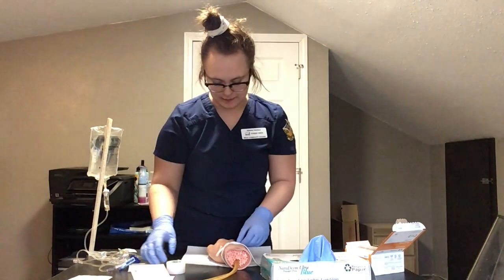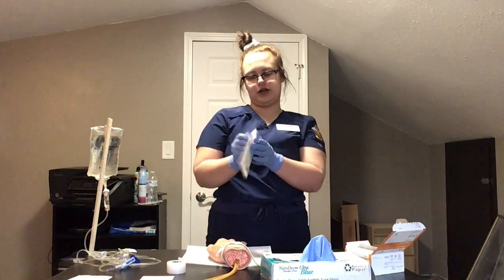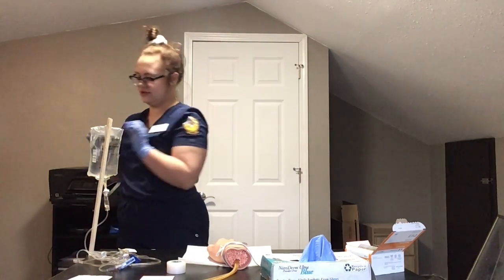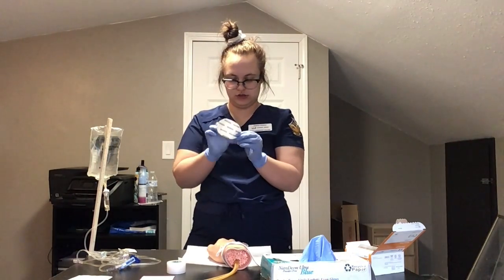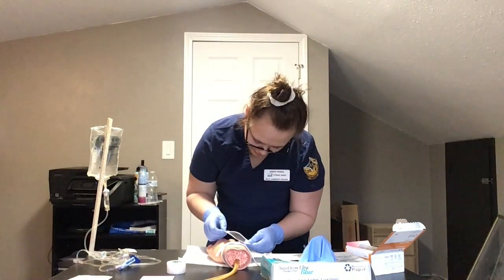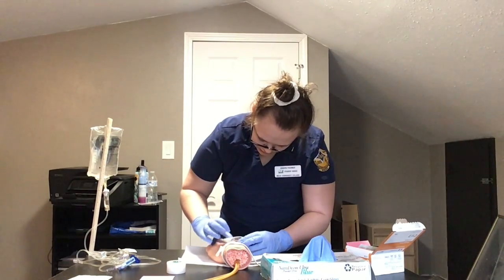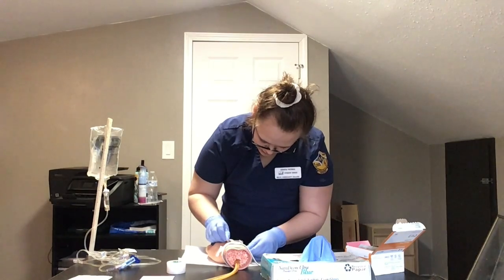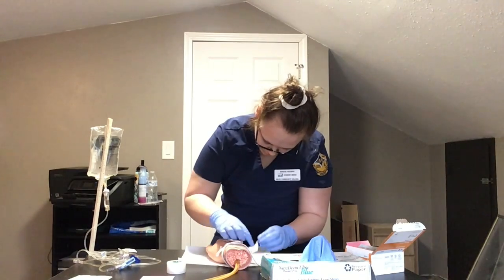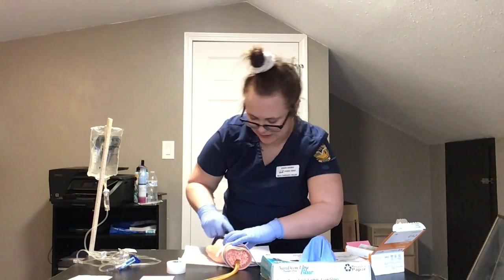Okay. Now that that is in, I'm going to get my transparent dressing. Be careful not to touch it where it's going to be on my patient. Place it over the IV site but not covering the port. And then I would label that with my initials and today's date and the time.